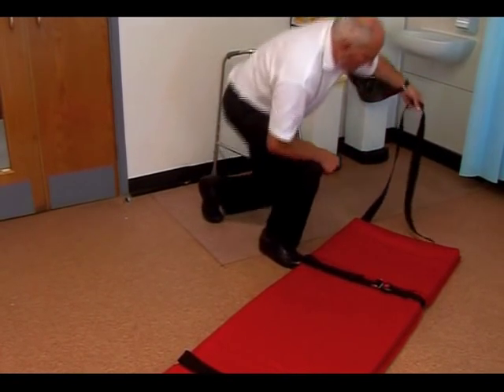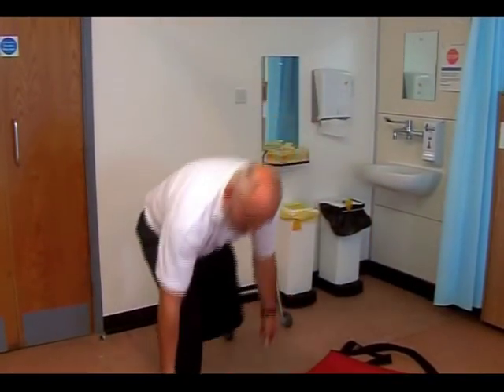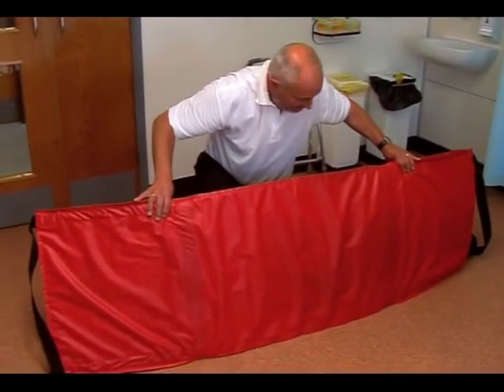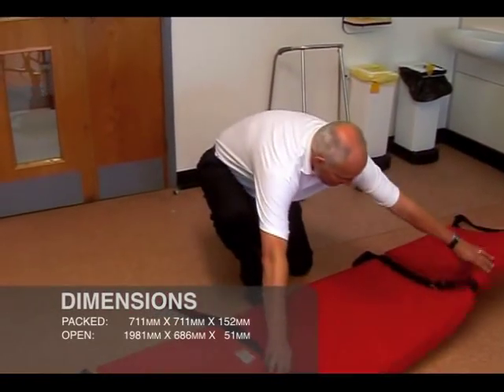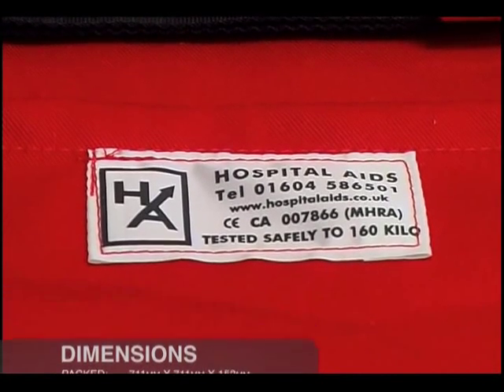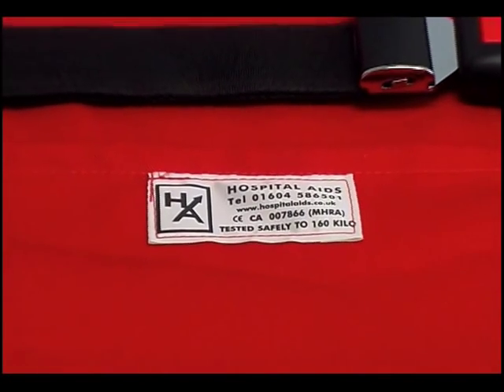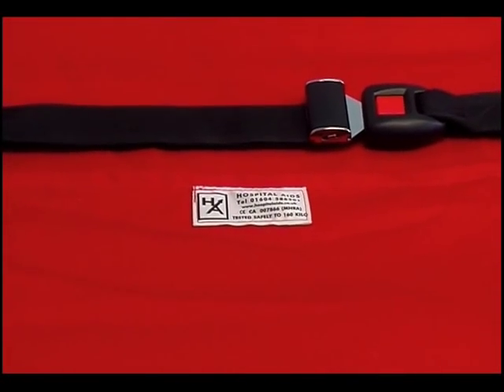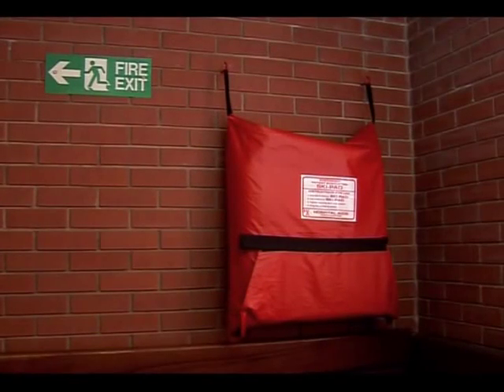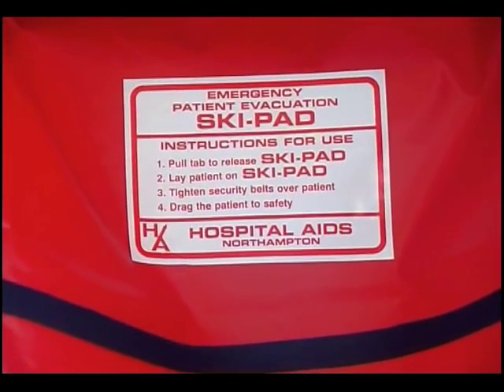The underside of the ski pad is manufactured from a very low friction vinyl material, which where it is being used for training purposes can be restored by the application of a polish spray and a duster. Ensure that it is dried thoroughly before further use. There is a label on the top of the ski pad which specifies the safe load tested weight of the components to 160 kilos. However, for reasons of balance and safety, we recommend a maximum patient or resident weight of 120 kilos. The ski pad is supplied with a vinyl case which has two webbing corner handles at the top, designed for wall mounting where space allows.